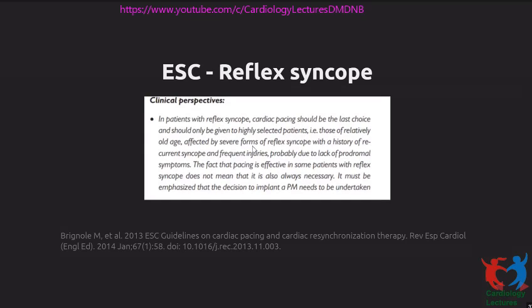Now, the ESC guidelines are even more conservative when it comes to this. So again, don't be misled by a lot of the trials and newer technologies which promise a lot of results in this. There is a very nice summary in the ESC guidelines, which says that in patients with reflex syncope, pacing should be the last choice, and should only be given to highly selected patients. This is typically relatively old age with severe forms of reflex syncope, with a history of recurrent syncope and frequent injuries. So it's typically an old person who has recurrent syncope and has injuries during the syncope.